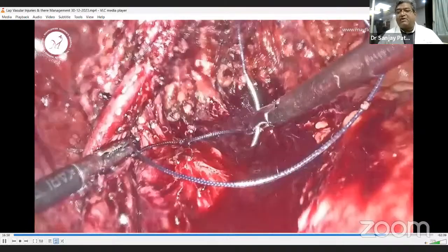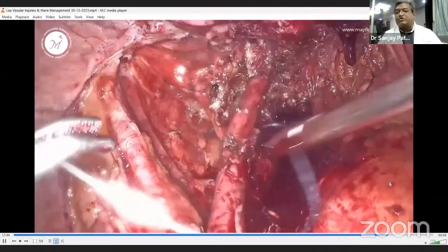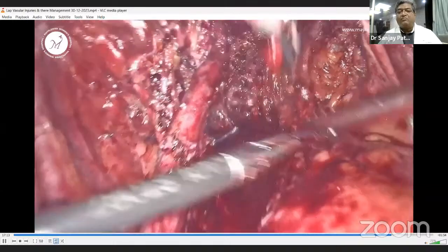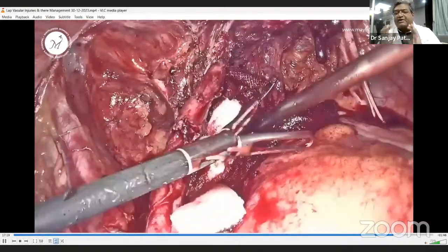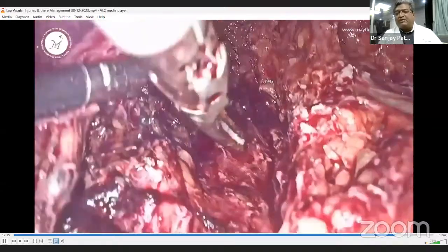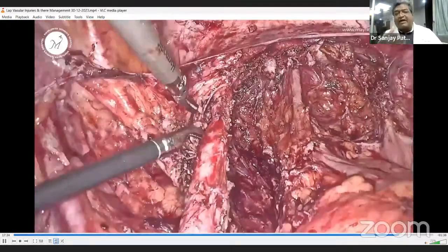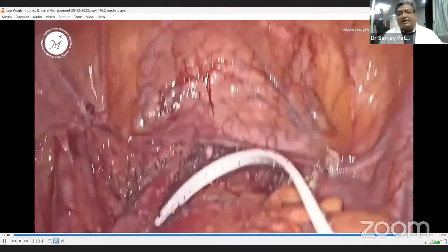So we managed it and we lively demonstrated it during this AGL workshop. But at that time, the most important part was presence of mind and patience. So now this is the end, and you look at it properly. We excise the entire disease parallel to the internal iliac vein, and we keep the drain, and we came out.